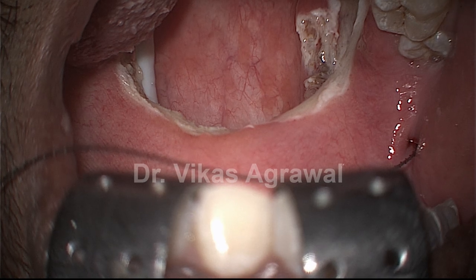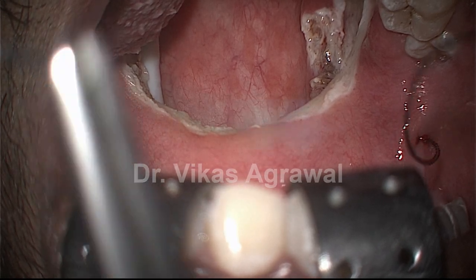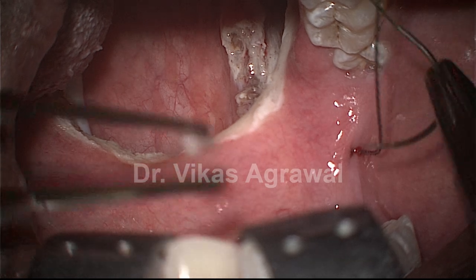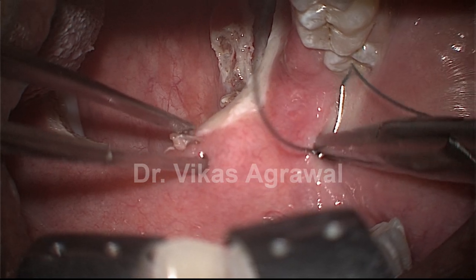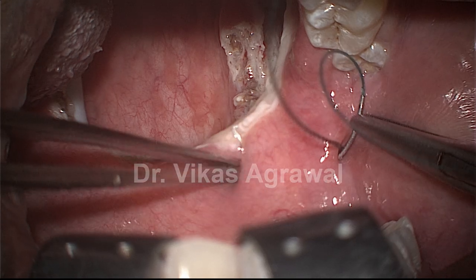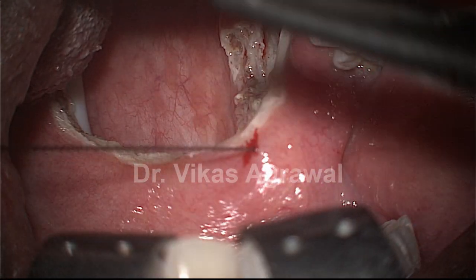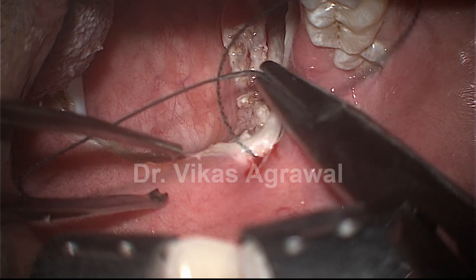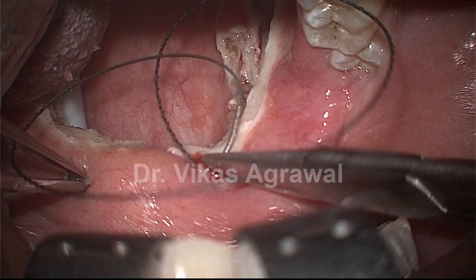Now we go for the anterior leg. The anterior leg will be from one pterygomandibular raphe to the other pterygomandibular raphe. We again start from the same point and come till the free margin of the soft palate — it will remain submucosal. Then again entry from the same point and we will cross the midline, going to the other side.